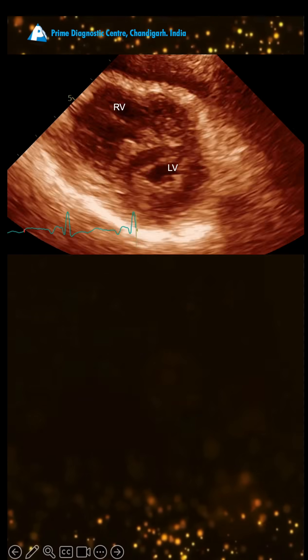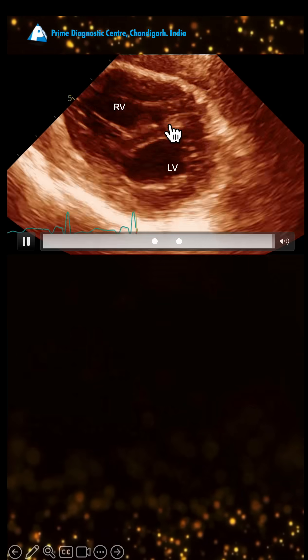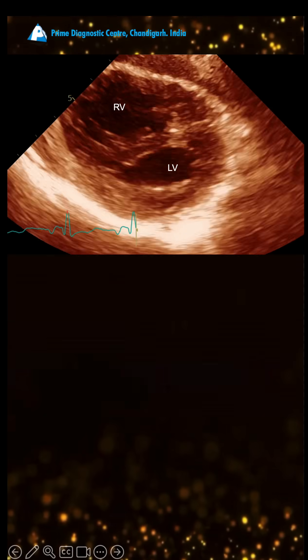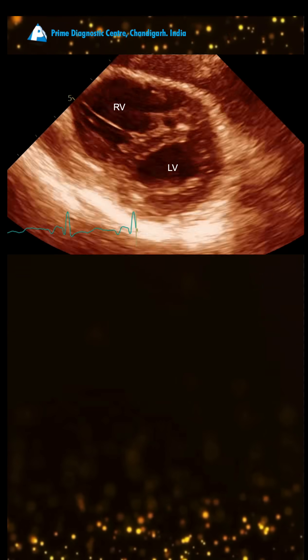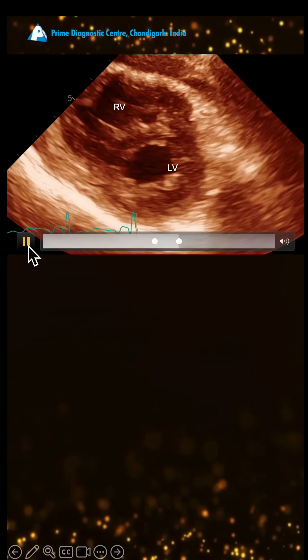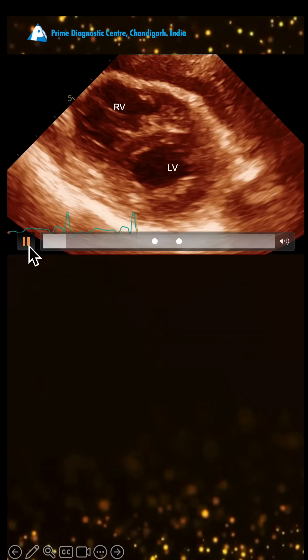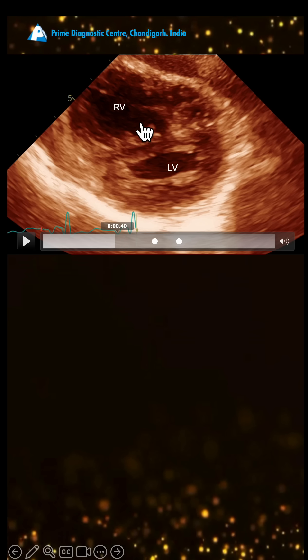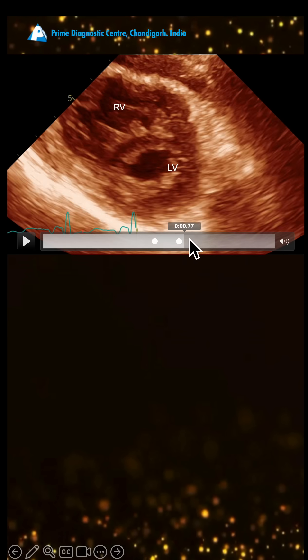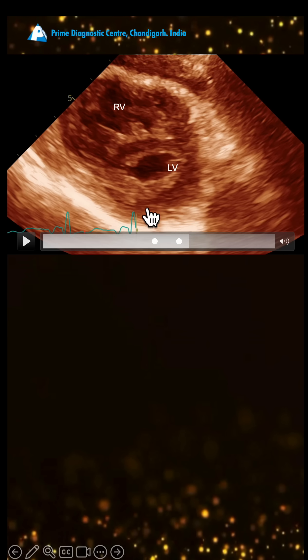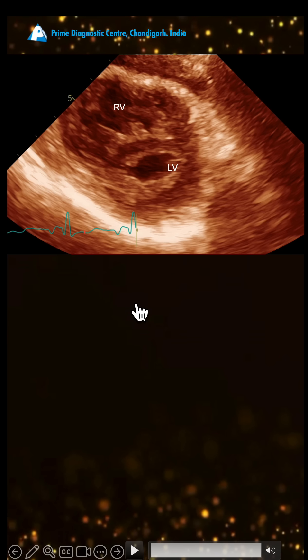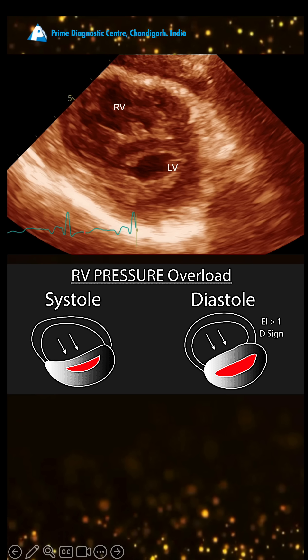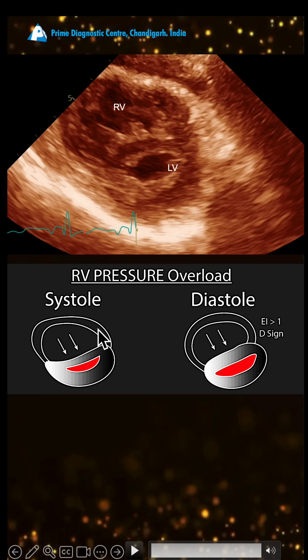This is a cross-section view showing right ventricular dilatation, with the LV and RV visible. Normally the LV should be circular, but here it doesn't look circular — it looks like a 'D'. This is called the D sign.